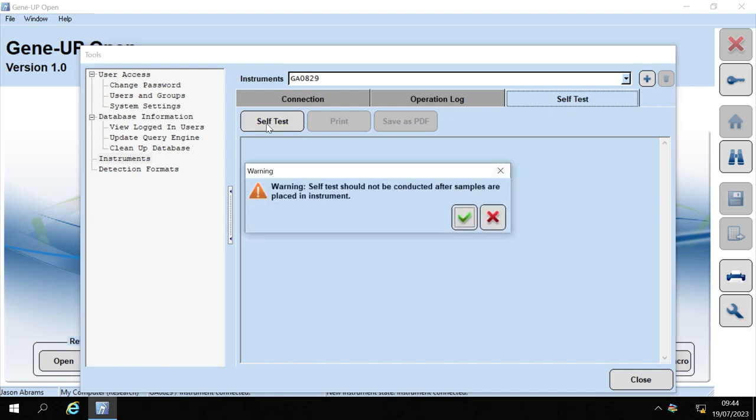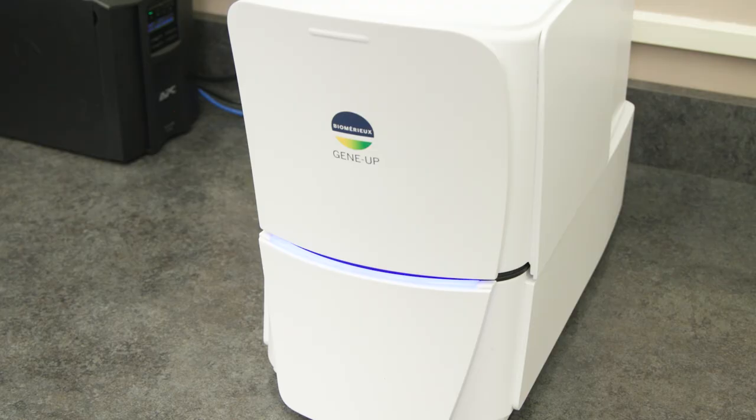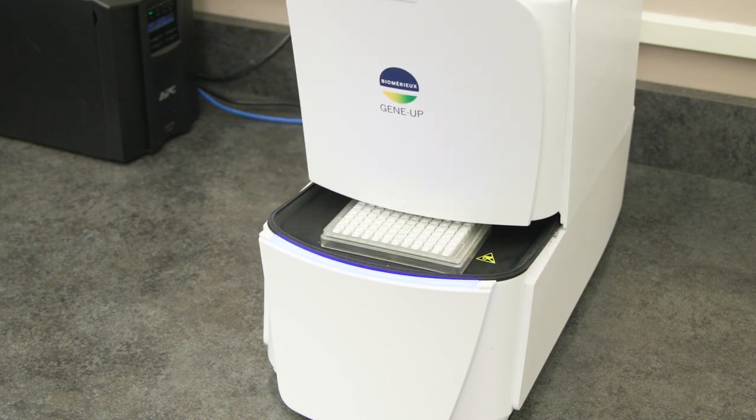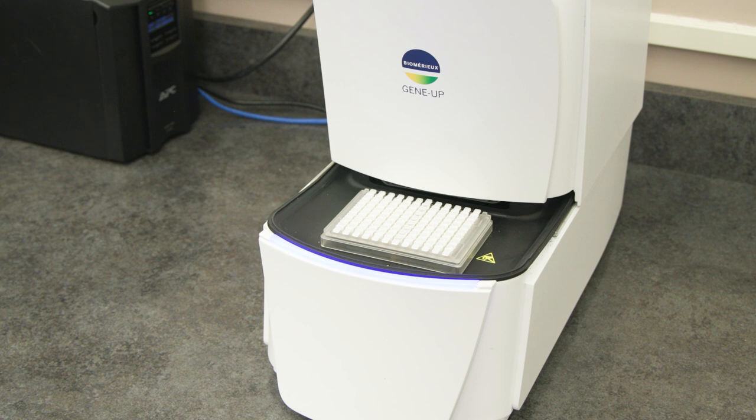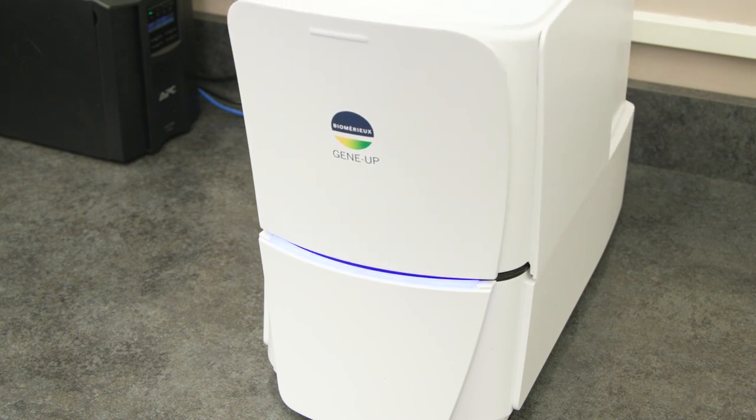A warning window will open. Warning: self-test should not be conducted after the samples are placed in instrument. Click the check mark. This is just to ensure you put the self-test tubes into the instrument before running. The instrument will run the self-test for about 5 minutes. During this process, the GeneUp door will open and close. Make sure not to remove the plate until the software tells you that it has been completed.